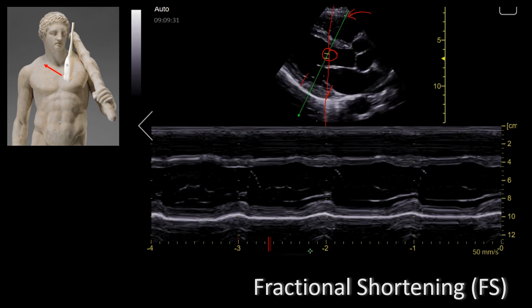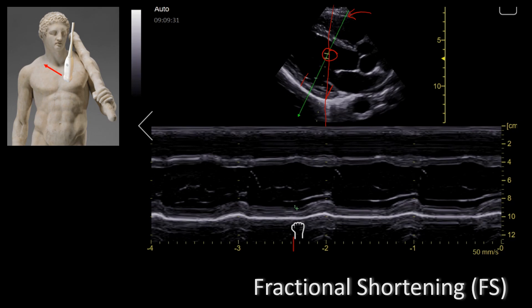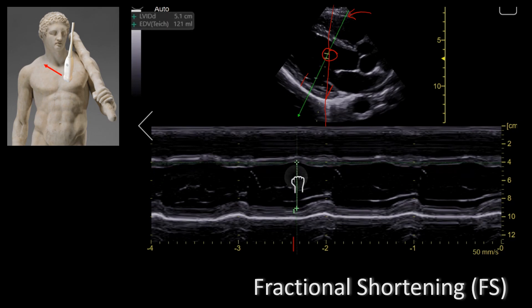After you get a good M-mode tracing you want to start making some measurements. You want to measure the endocardium from the end of diastole to the end of systole. What you're basically measuring is the percentage decrease of the left ventricular end-diastolic diameter that occurs by the end of systole.